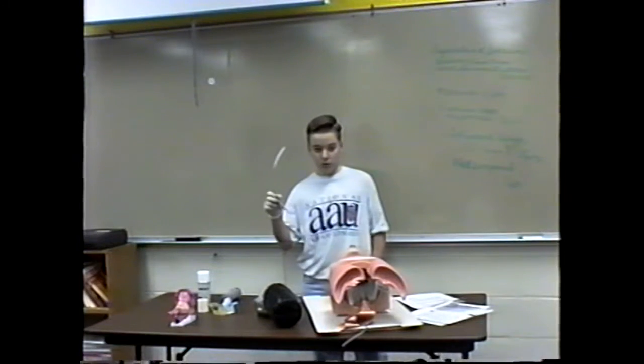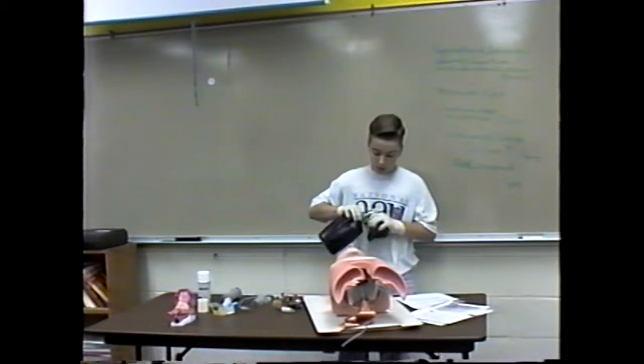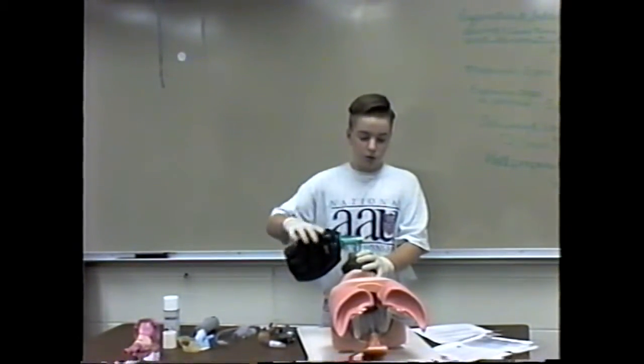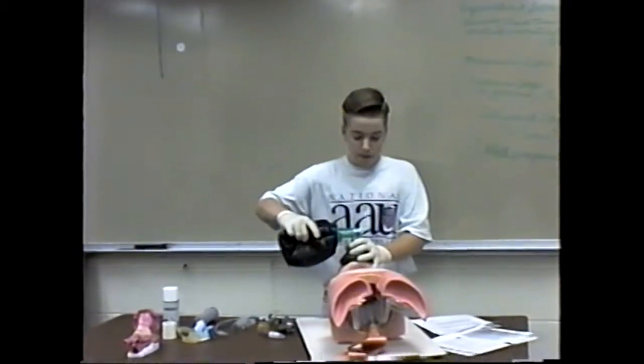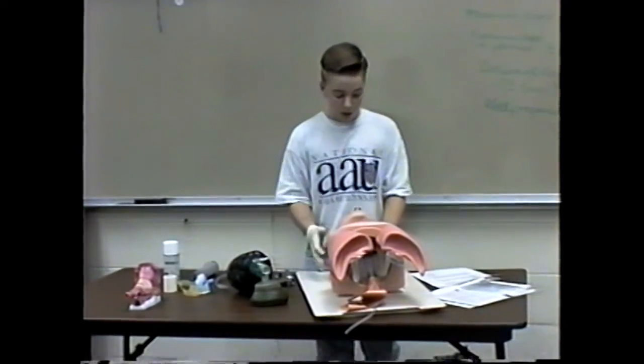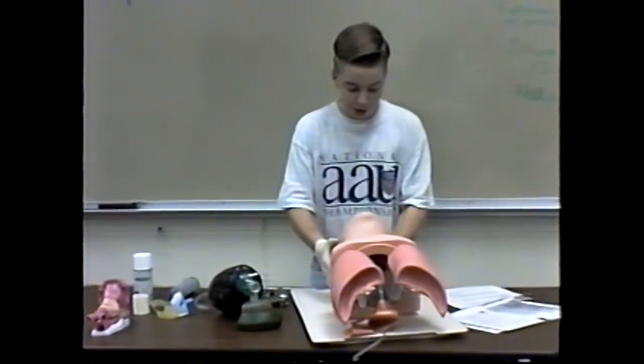First, what you do for the endotracheal intubation is hyperventilate the patient, which you can see the lungs moving up and down. And once you are ready to intubate, you tilt the head to the appropriate position.